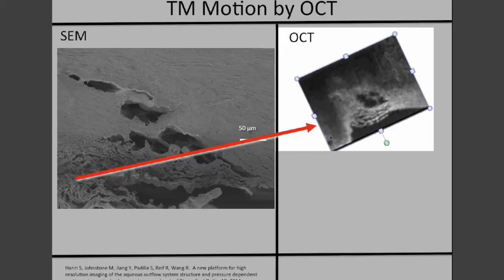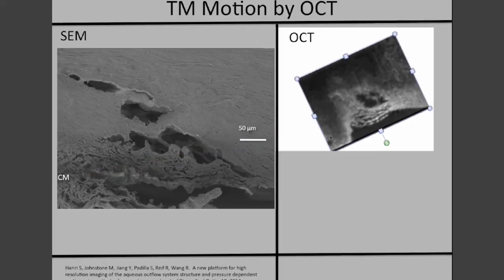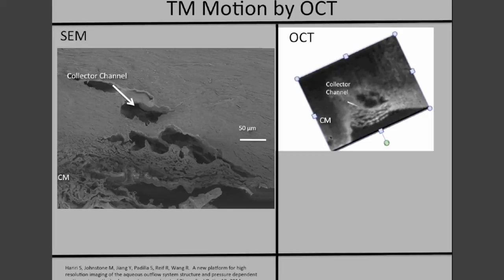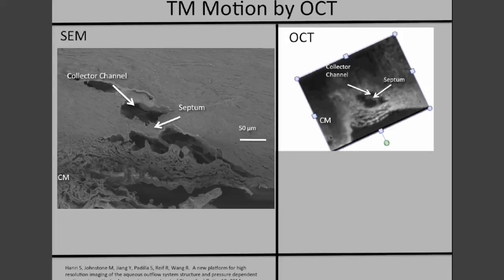Comparison of scanning electron microscopy with OCT indicates that the OCT images in our system are capable of high resolution almost comparable to scanning electron microscopy. We can compare the images with ciliary muscle in both the trabecular meshwork, Schlemm's canal, collector channels, septa separating Schlemm's canal from these intrascleral collector channels, and the cylindrical attachment structures spanning between the trabecular meshwork and Schlemm's canal.